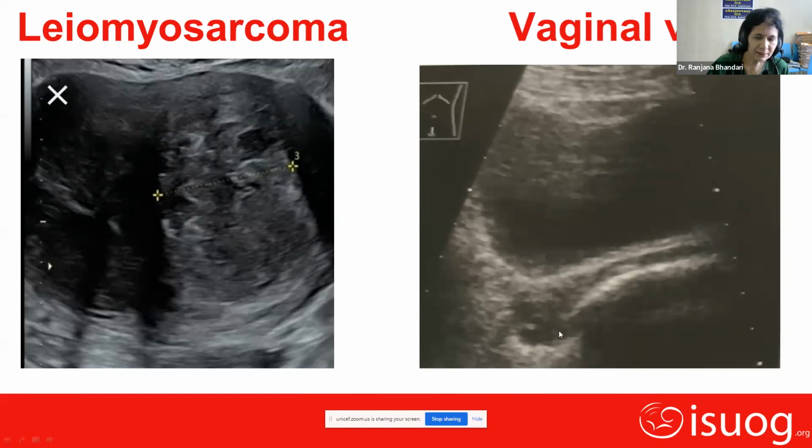See, it should be hypoechoic and very, very thin, unless it's a case of subtotal hysterectomy. In the subtotal hysterectomy, it is slightly thicker and nodular because of the remains of a slight amount of the uterus. So in the total hysterectomy, it is very thin and hypoechoic. And this is the vagina.